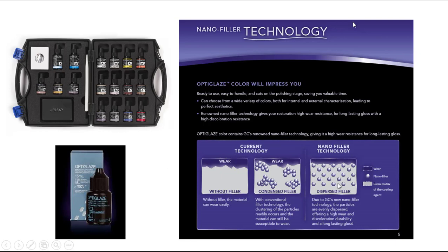And the situation is, again, overexposure, which technically they call burning. It's not literal, but the burning creates a browning of that suspension material, and thus there's a situation with discoloration down the line. By the way, the calls that I'm getting are not from people who get it immediately, but it generally is done, and then a week or two or a month later, they'll get a call that the restoration that they used the clear on had turned colors. So I want to address that now.